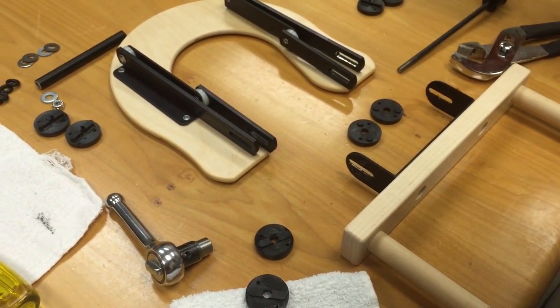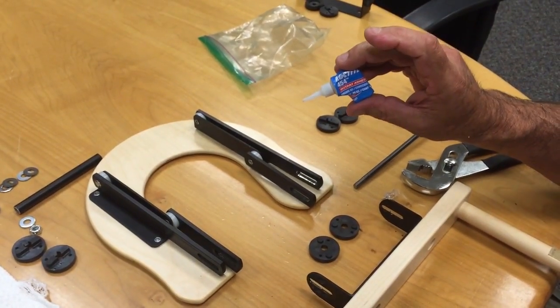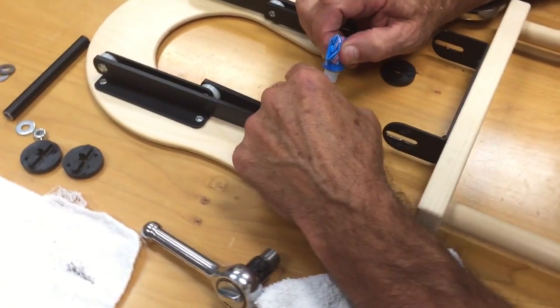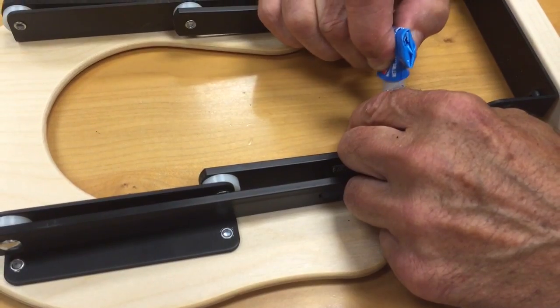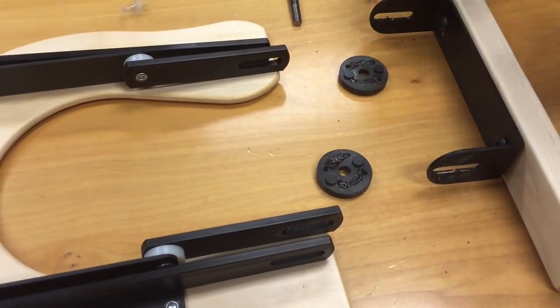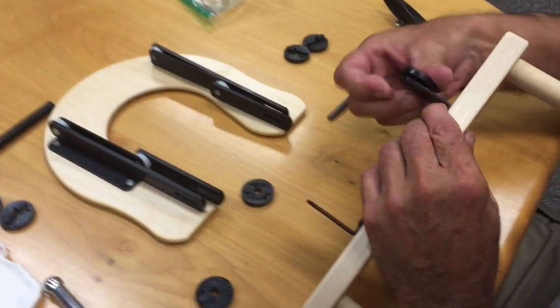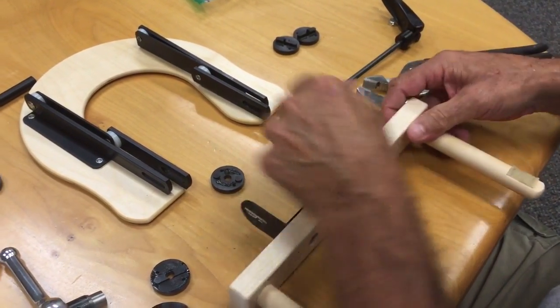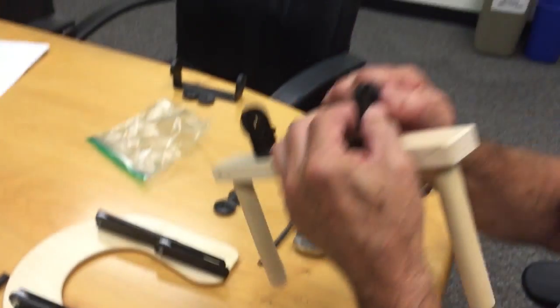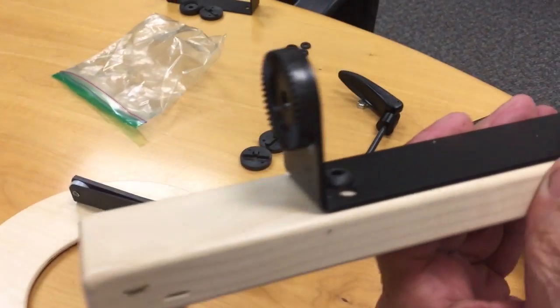To glue these discs on, we'll use a small amount of super glue. This happens to be Loctite 454, very high quality super glue. We put a small amount on the disc like such, on both discs. And then simply apply them to your FaceRest. And you want to ensure that there are no large gaps at all between the discs and the metal bracket.